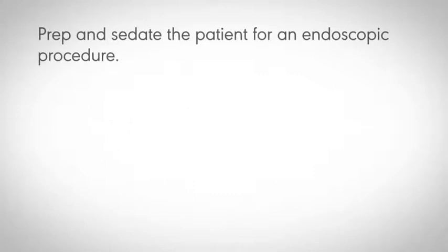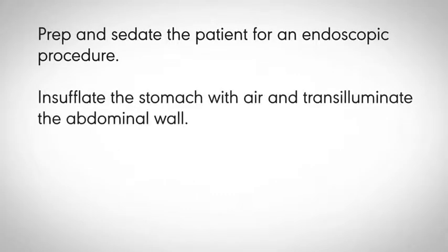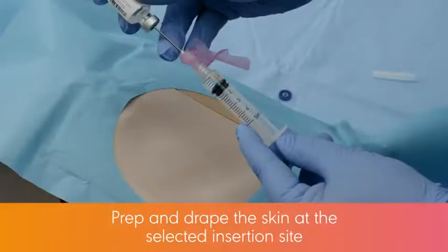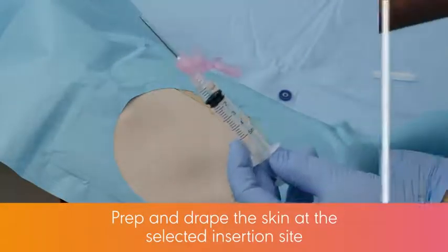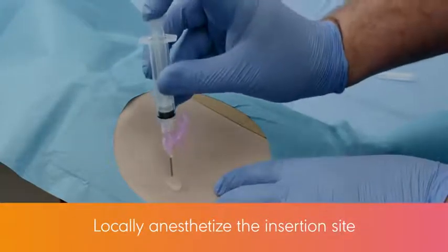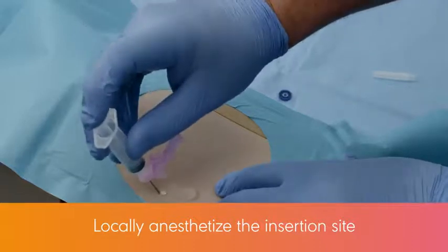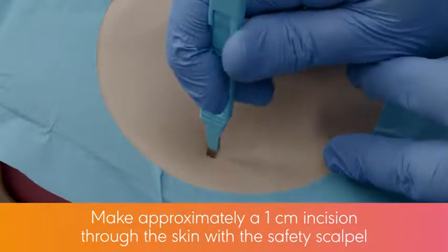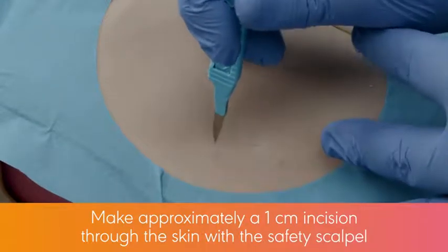Prep and sedate the patient for an endoscopic procedure. Insufflate the stomach with air and transilluminate the abdominal wall. Select the gastrostomy site. Prep and drape the skin at the selected insertion site. Locally anesthetize the insertion site. Following local anesthesia, make approximately a 1 cm incision through the skin with the safety scalpel.